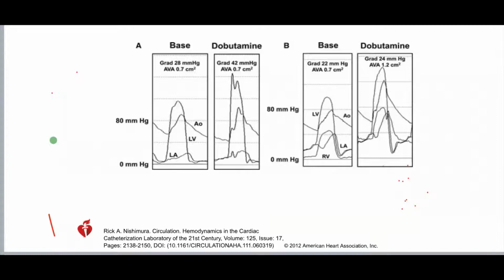Yeah. The LV wave, yeah, it changes because there is increased contractility. And when you have increased contractility, the pressure goes up. Okay? Contractility means more flow means more pressure. It's only the increase in contractility. So now if you count the contractile reserve, it should be more than 20%.